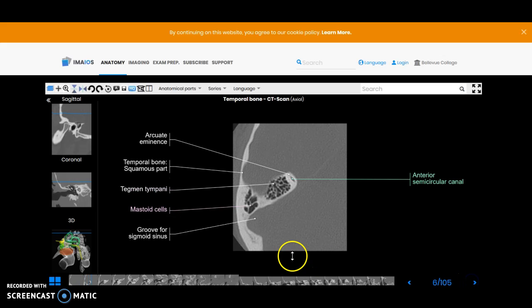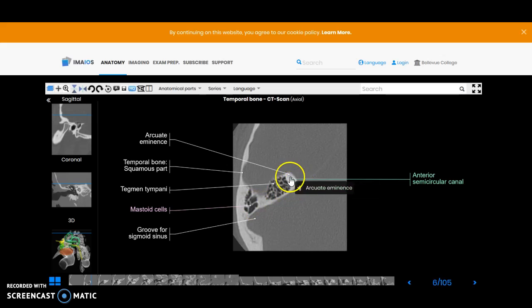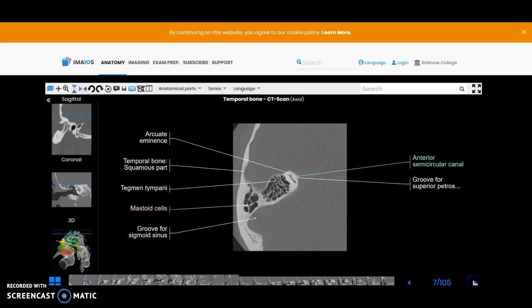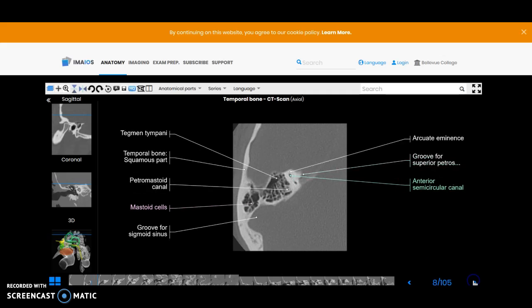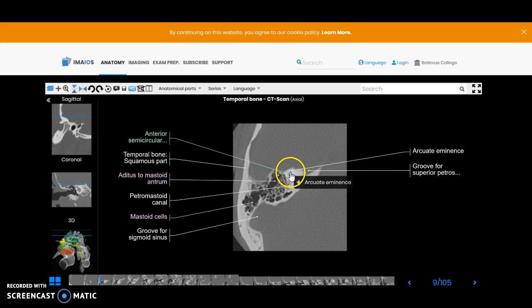More of the mastoid air cells and you're catching the very top part of the anterior semicircular canal. And again you're catching just slices of the two semicircular canals here.